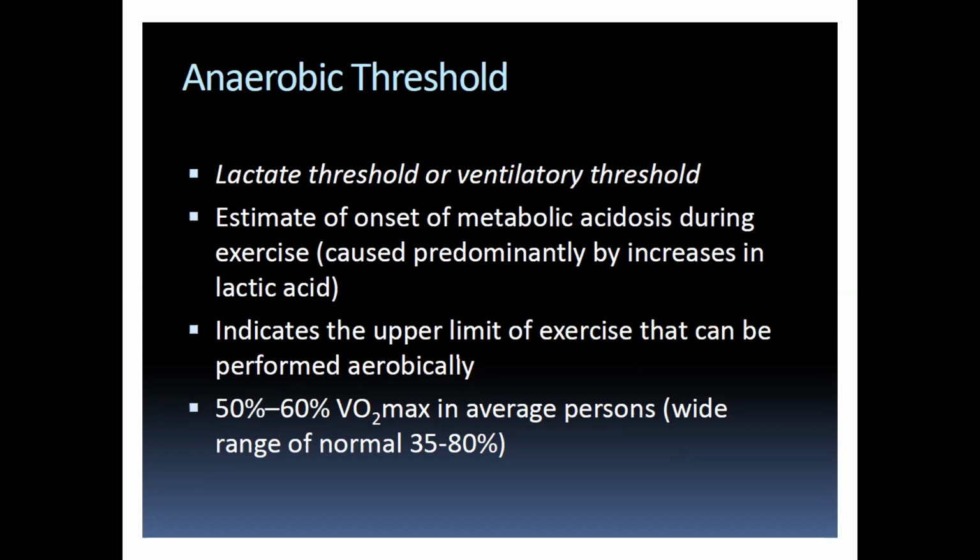Now, when there is lactic acidosis, the initial buffer that is present in tissues is bicarb. So bicarb buffers lactic acid, and the byproduct of that is CO2 and water. So that means that the initial carbon dioxide production was from aerobic metabolism. Now there is additional CO2 production as a result of buffering the lactic acid production. Once the VCO2 increases, this increases your minute ventilation. Your minute ventilation goes up significantly after you reach anaerobic threshold. I will show you that in the form of the plots in just a moment.